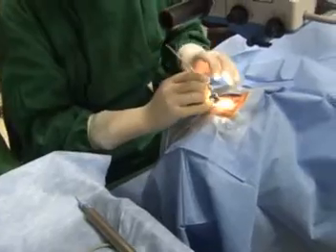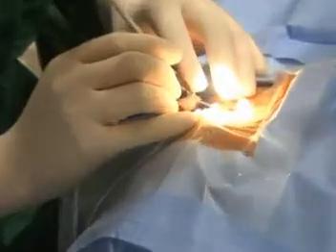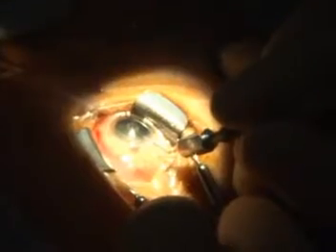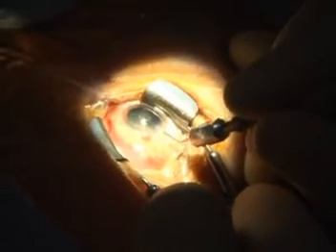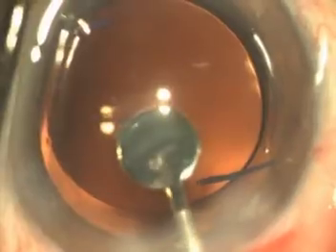The multiple irregular patch-like lesions turned out to be an area of endothelial cell loss, and this means that the intraocular mirror is useful to detect endothelial cell damage intraoperatively. To date, no other tool or device that enables demonstration of endothelial cell damage during cataract surgery has been reported.